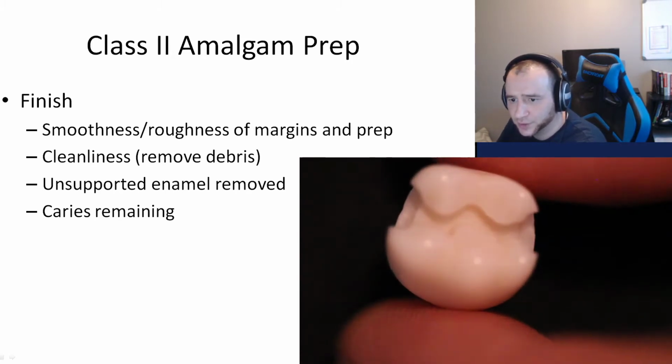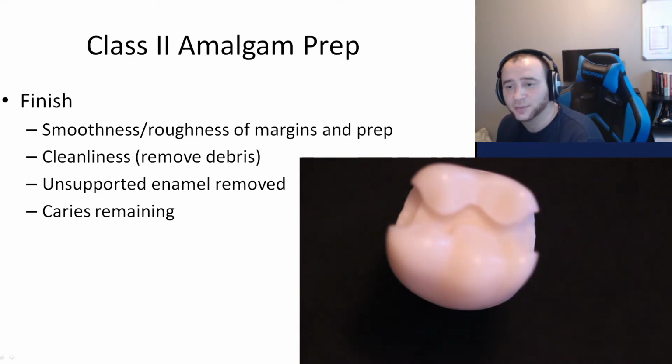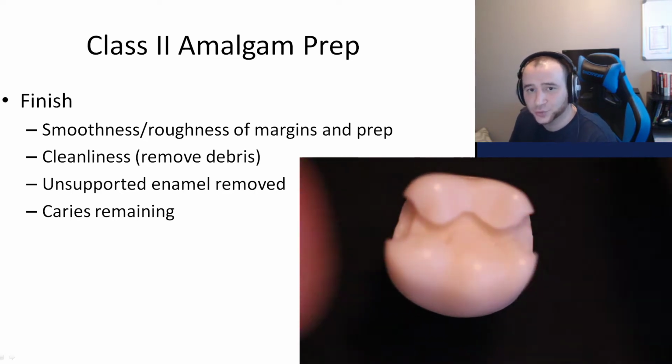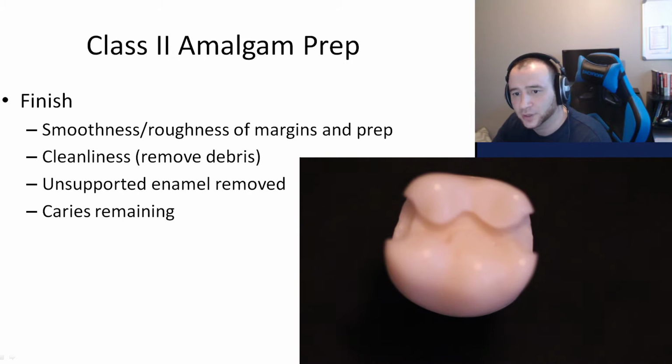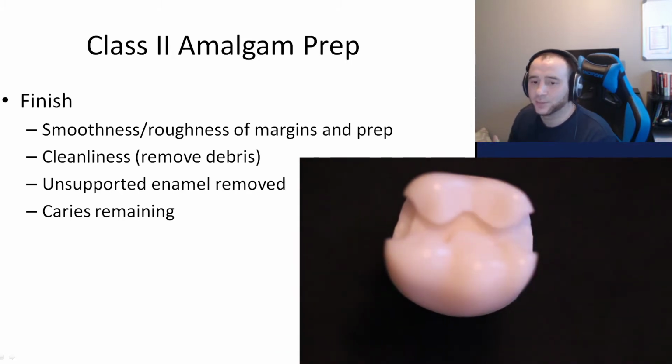That's just one thing here. So no roughness, and cleanliness. Make sure you wash the tooth. It's very easy to get an A if you focus on this a little bit. So remove debris. Don't leave the powder from the tooth that you're preparing in the tooth. Make sure you rinse it with water and air water. And then you have the unsupported enamel removal.